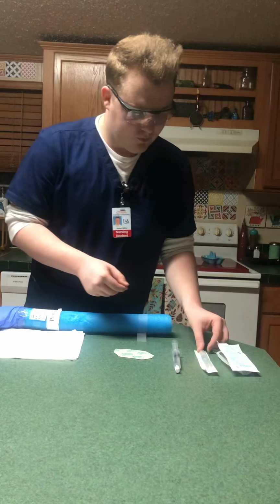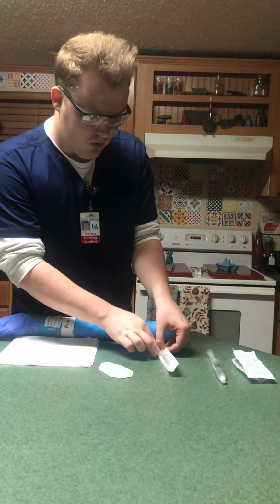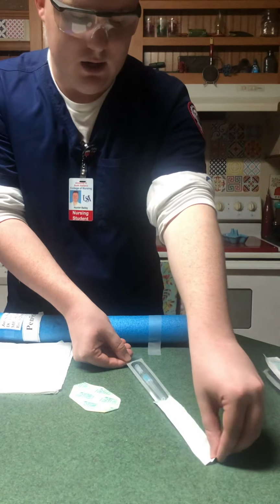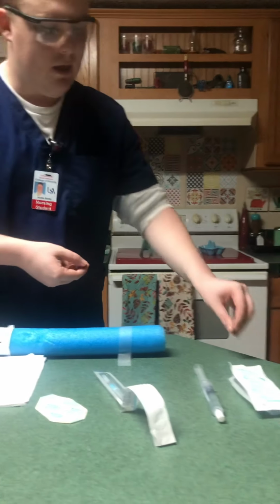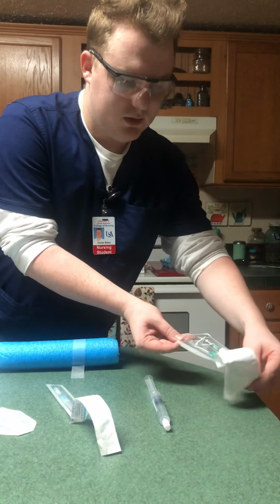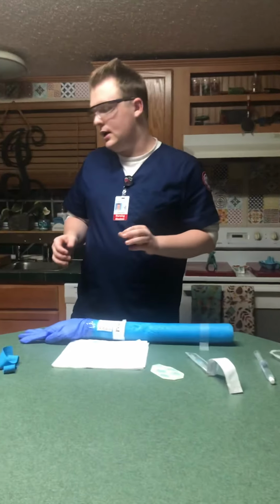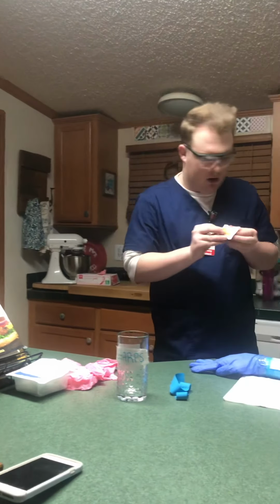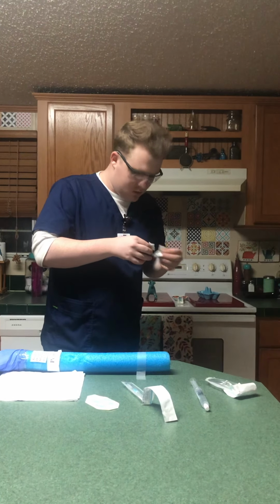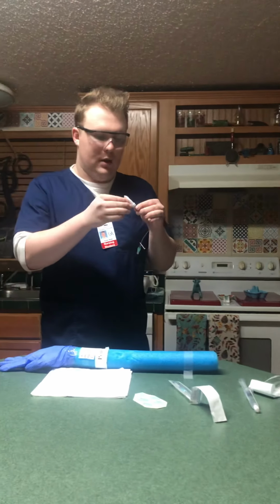I'm going to move my 10 milliliter syringe over. This is my over-the-needle catheter, so I'm going to open it using sterile technique. And then I'm going to get my J-loop, and I'm going to open it as well using sterile technique. Okay, so now that I've opened it using sterile technique, I'm going to get my alcohol swabs, drop this in the trash, and grab my J-loop, and I'm going to swab the injection cap.